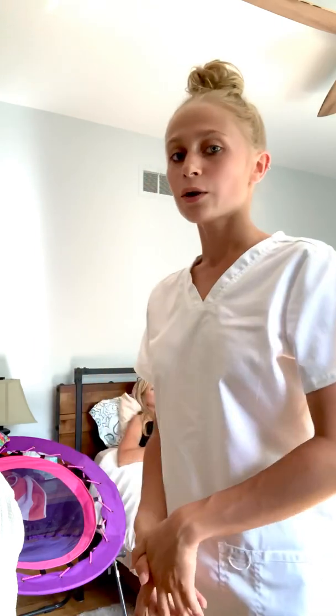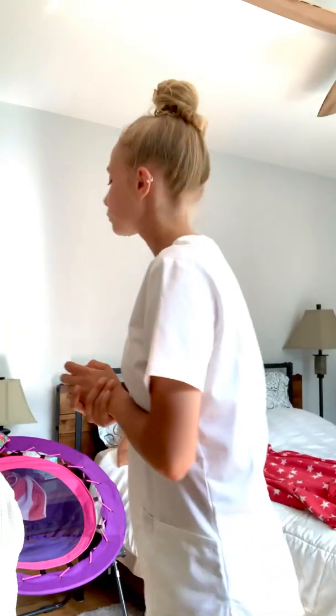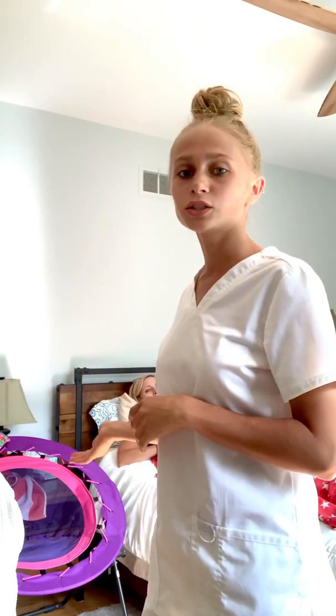So the first thing that we're going to do is look at the care plan and see what my patient's affected side is. So her affected side is the left side, so we are going to be transferring her on the right side today. So I positioned the wheelchair on her strong side, and it's not touching the bed, but it's super close to the bed.